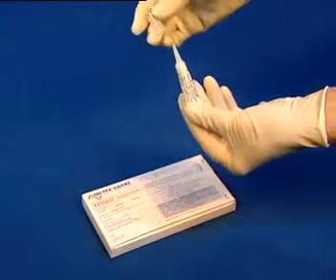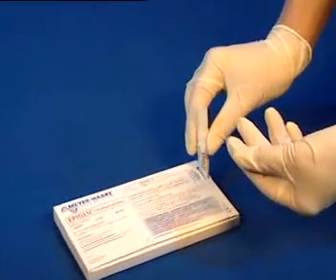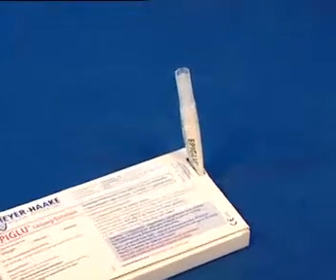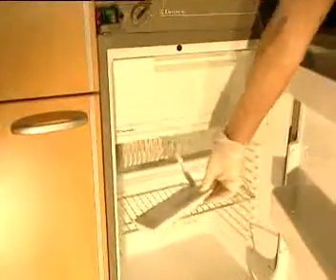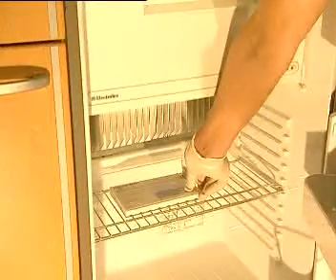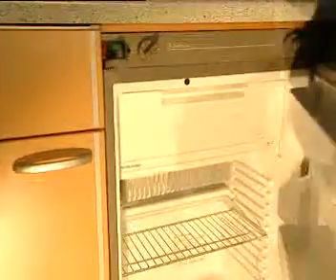Close the tube by placing the upper cap loosely on it after use. Place the tube in the perforated opening of the box and store it in the refrigerator, or even better, in the deep freezer. Cold storage prolongs the shelf life of Epiglu, and since it will not freeze into a solid block, it may even be used coming directly from the freezer.